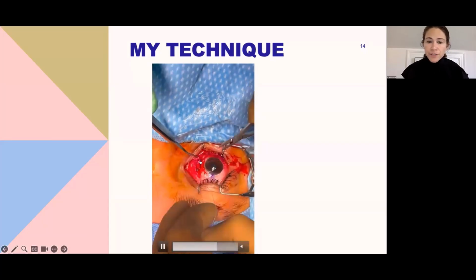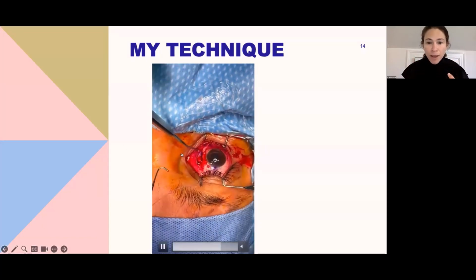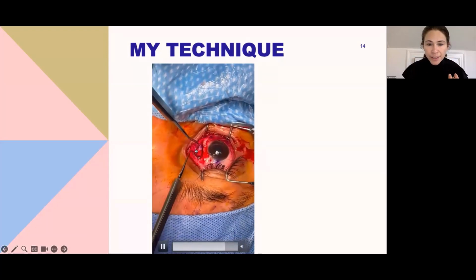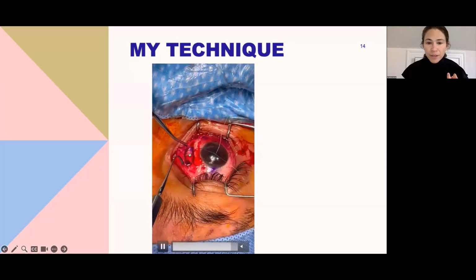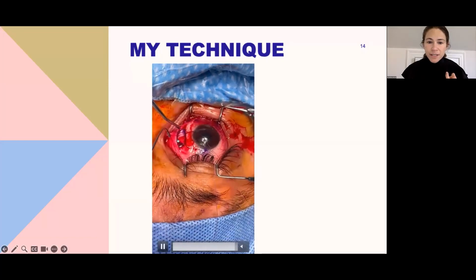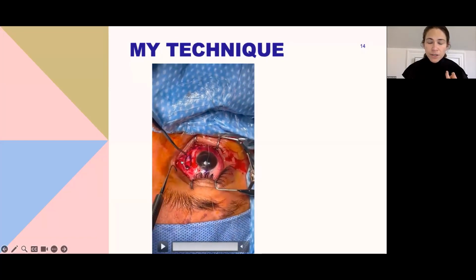And I do that a few times. I try not to pull with a lot of force. I try to be as gentle as possible, but you can see here the muscle's folding really nicely, and you have a little bump here. You can take the hook out once the muscle starts to fold. I just left it in there to demonstrate in this video the fold. And so, after that, you can pull the hook out.